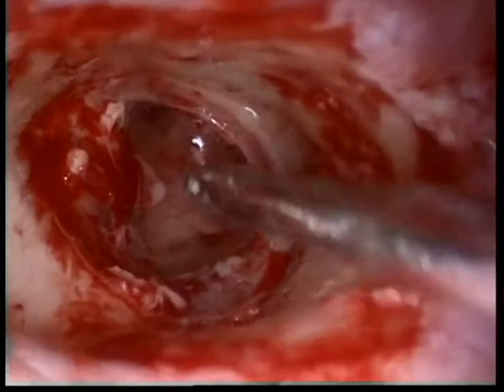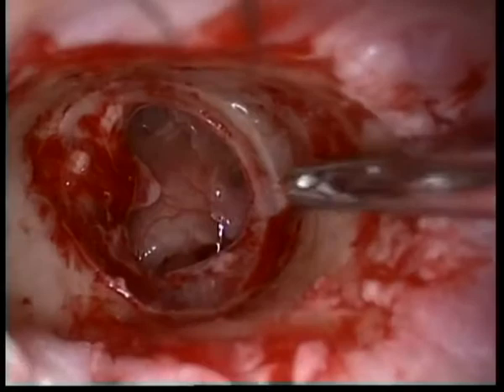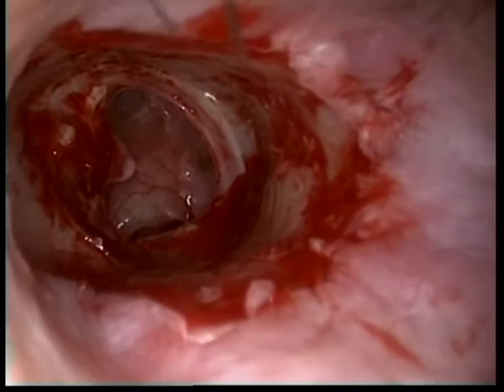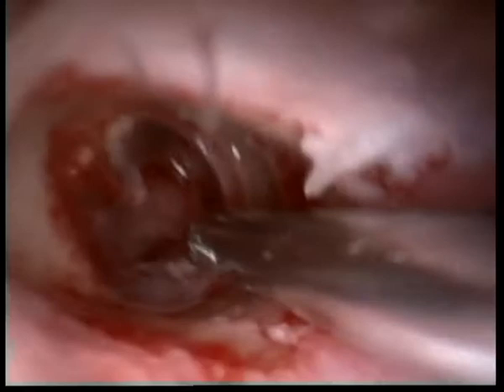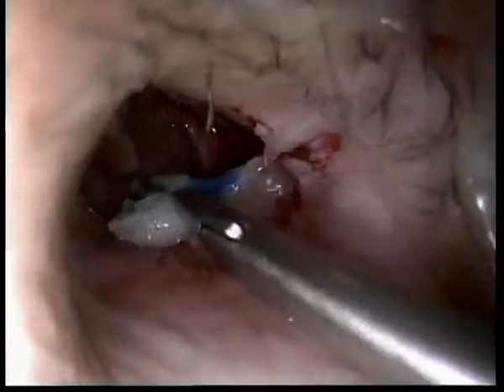I've already measured the opening pressure of this patient, so I know the eustachian tube. What is it, 40? So give me more pledgets. Not the pledgets, give me an irrigation. Can I change this actually? Yes, thanks. Give me one. Pledgets. Apply some pledgets while I'm working.